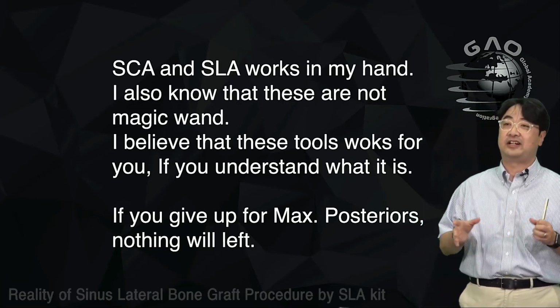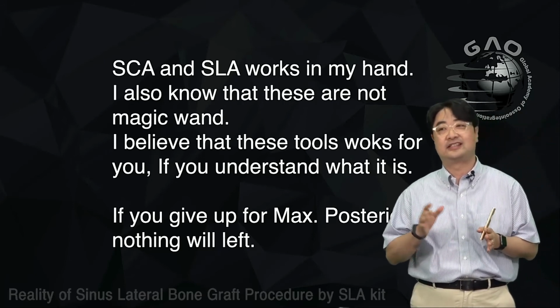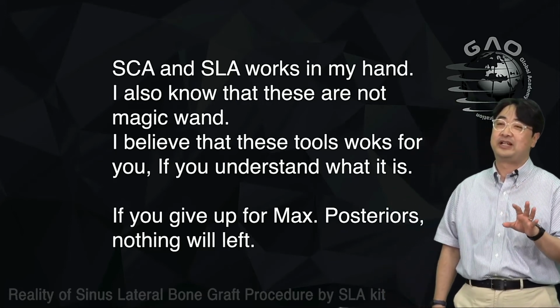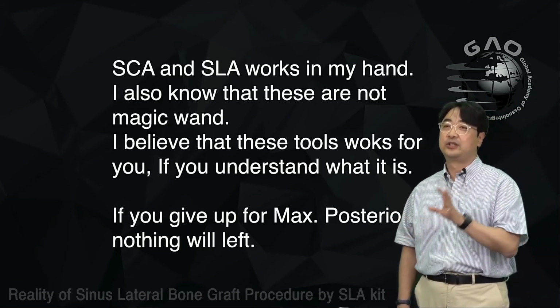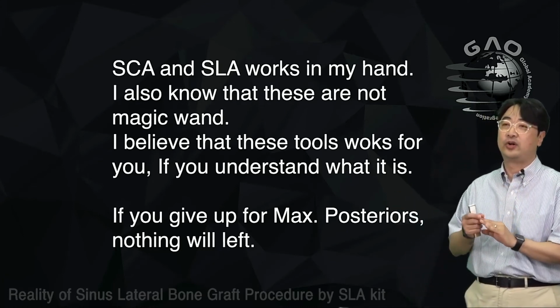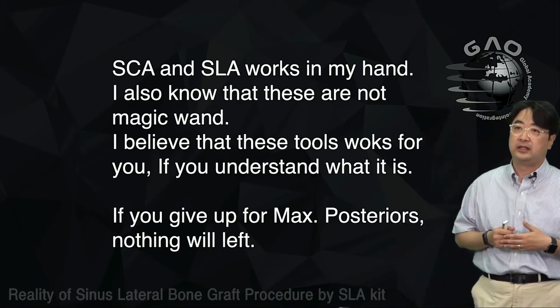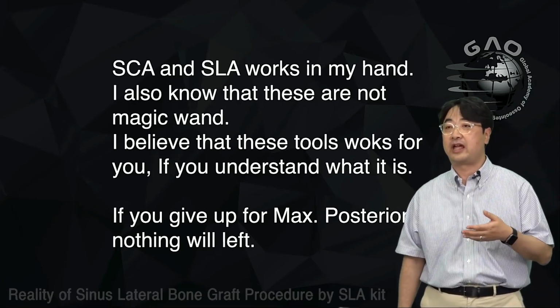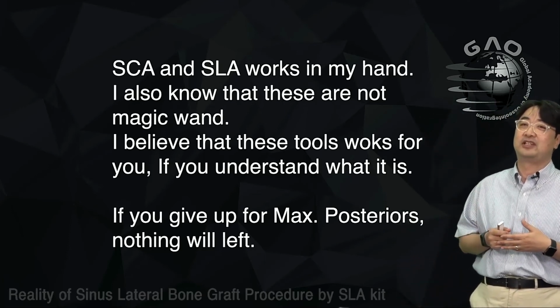These days there is even a kit called the Sinus All Kit, which includes the SCA and SLA all together. So when I have a sinus surgery, I always tell my assistant I'm going to need the SCA and SLA, or the Sinus All Kit, right? You don't have to have all three. Either you can have the SCA and SLA, or the Sinus All Kit, right? But those kits save me a lot of time. And also it's good for my assistant. After surgery, they don't have to spend too much time cleaning the instruments and resetting them.